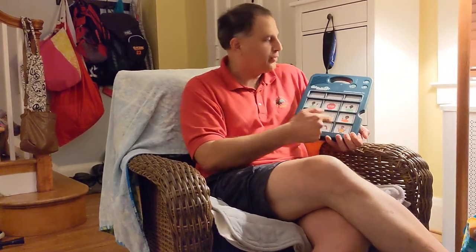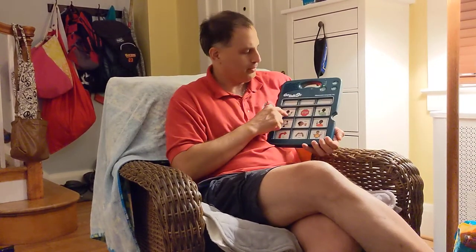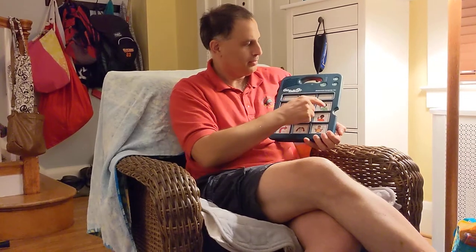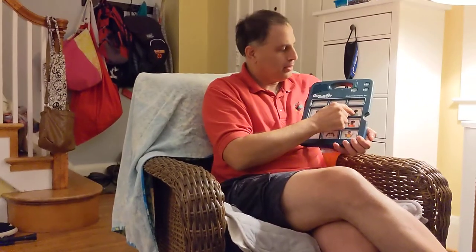You can also record a whole bunch of messages at once. For example, this device has my voice on it already. Let me turn up the volume. "Hello." "Stop." "Bye." So, that was my voice.